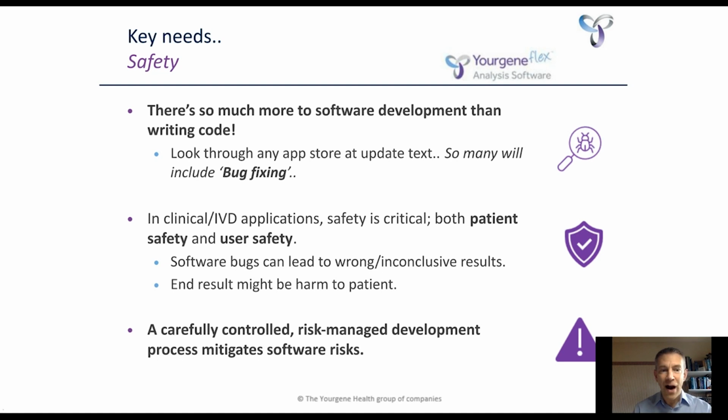Obviously in clinical or IVD applications, safety is critical, whether you're talking about patient safety or user safety. With software, user safety arguably doesn't come into it quite as much as it may do with an instrument that's got motors and is physically moving things around.